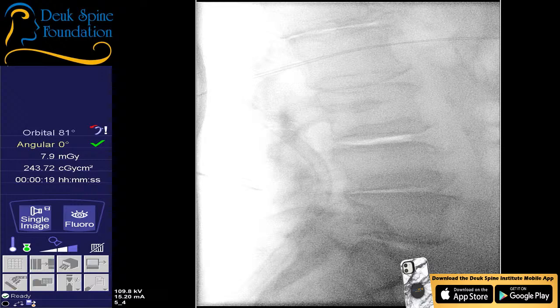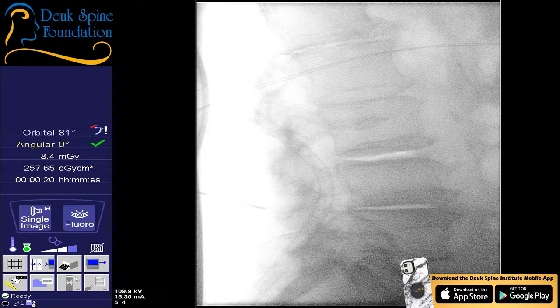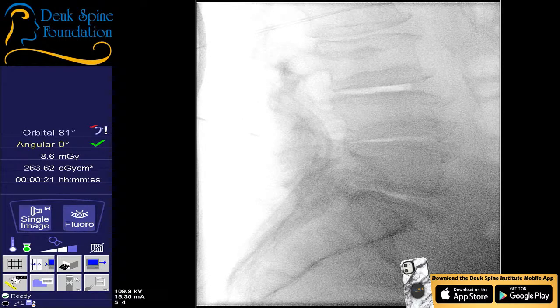So the navigation part is, the starting point is the skin, and the ending point is the herniated disc we're trying to fix. I think it's worse. A lot worse. So I'm navigating from the outside, or the skin surface, the entry point we call it. I'm navigating from that point. All right, let's try that. Let me see the wag. I think we're still off a little bit.